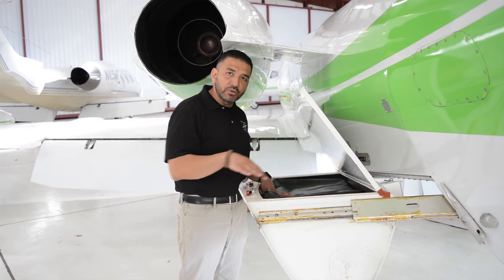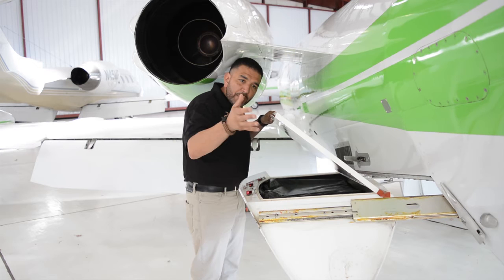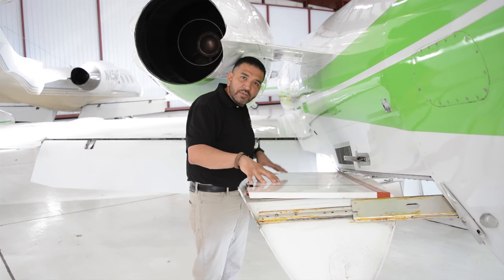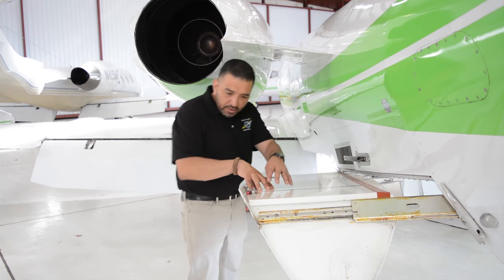So for proper closure of this latch, we're just going to bring it down slowly. Remember, all of these exterior surfaces and compartments are very gentle. They're aircraft aluminum, so we want to be gentle. Nothing needs to be forced. If something is being forced, we're usually not doing it right. So I'm going to bring this latch down, and bring all these latches into the locking position again.